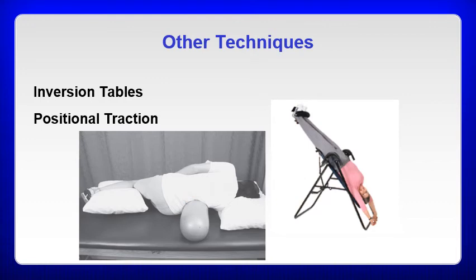You can also utilize the inversion table. The inversion actually works really well. The biggest thing is the patient's tolerance to being upside down. Some patients can't tolerate being upside down for the time frame that they're in traction for. Typically what they suggest is to build up to 3 sets of 5 minutes, and then you could possibly extend the time. They also recommend, particularly if they have a disc issue, to have them lay on their stomach and relax in a slightly extended posture upon finishing up the inversion treatment.